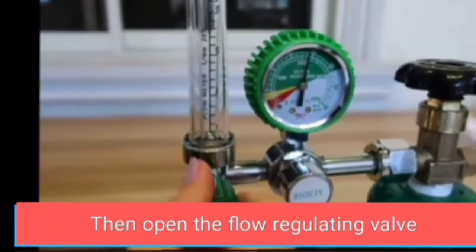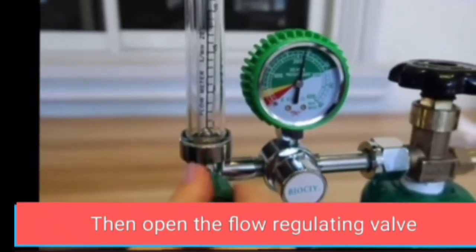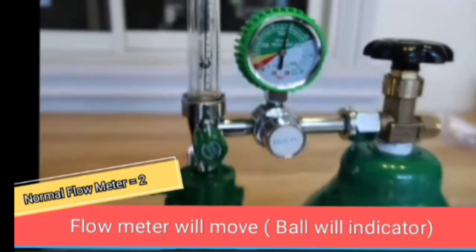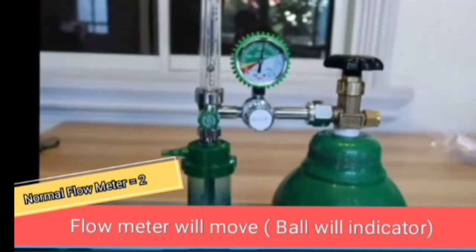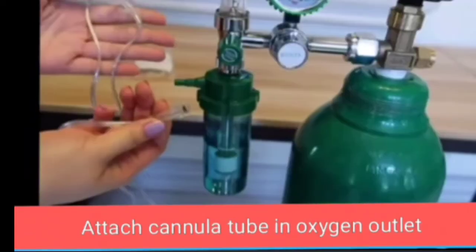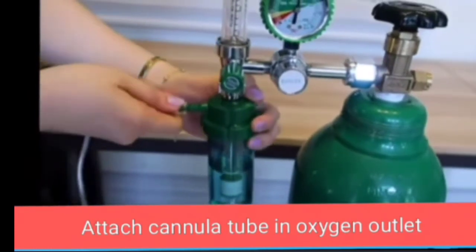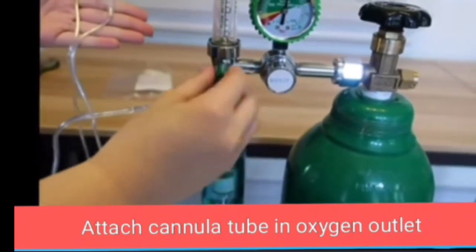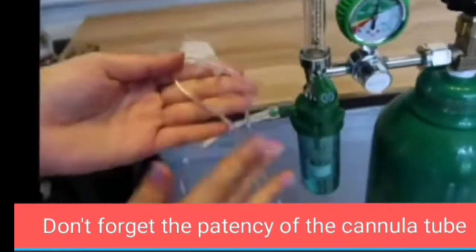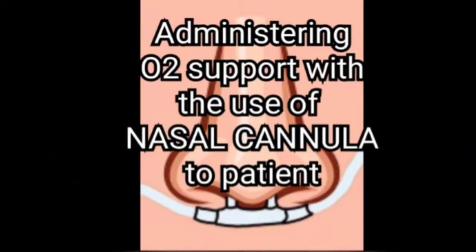Open the flow regulating valve. The flow meter will move. The ball will be the indicator. The normal flow meter setting is equivalent to 2 liters per minute. Attach the cannula tube to the oxygen outlet. Lastly, don't forget to check the patency of the cannula tube. Let's start!